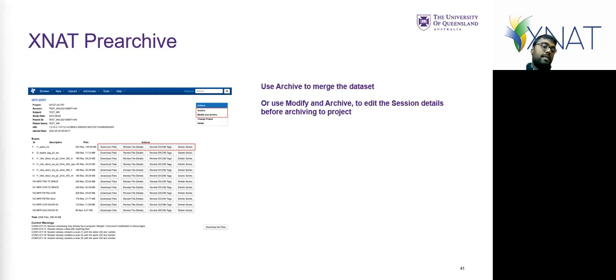And if your data set was sent without the project information, you won't have access to it on the pre-archive, only the admins will. So if it's there, we'll have to have a look at it. We look into the pre-archive every couple of weeks or every few days because it's on a caching disk and not on the long-term storage, so we can't have it fill up. If you see data sets accumulating, we'll probably send you an email and ask what we should do with the conflicting data.